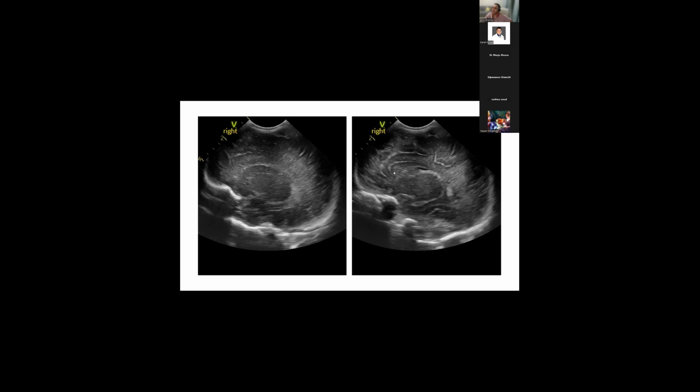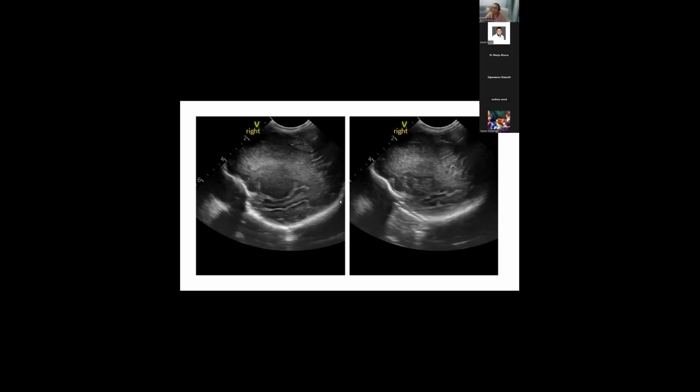It's somewhere between the midline because I can see the corpus callosum on this side. And because the baby's moving, it's difficult for me to keep the baby's head in the midline. So I really struggle to open up that C. But when I looked at my coronal views, I didn't see anything that concerned me with regards to hemorrhage. So I've settled with these images.